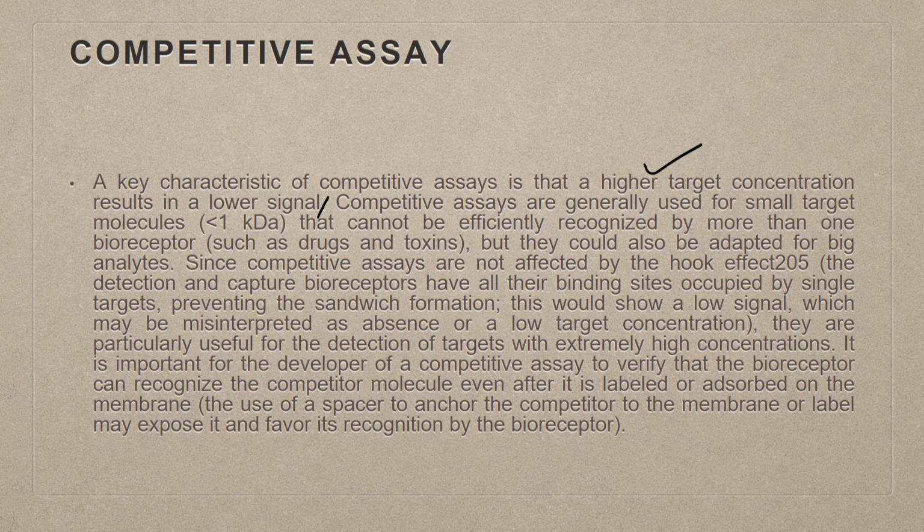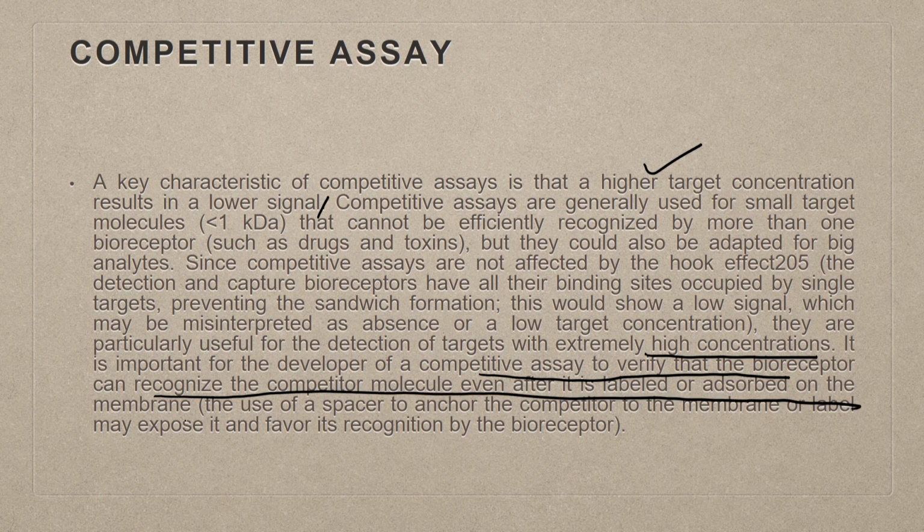Competitive assays are not affected by the hook effect, where the detection and capture bioreceptors have all their binding sites occupied by single targets, preventing sandwich formation. This would show a low signal, which may be misinterpreted as absence or a low target concentration. They are particularly useful for detection of targets with extremely high concentrations. It is important for the developer of a competitive assay to verify that the bioreceptor can recognize the competitor molecule even after it is labeled or adsorbed on the membrane.